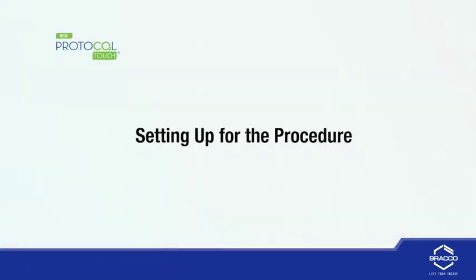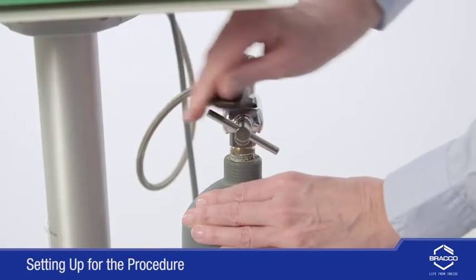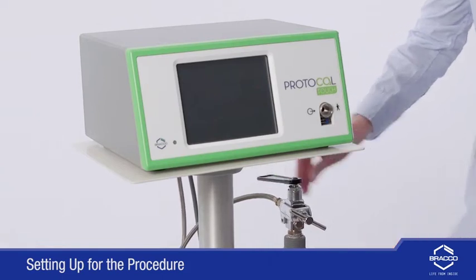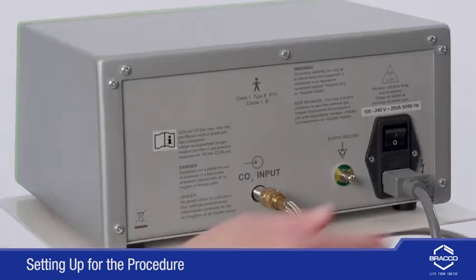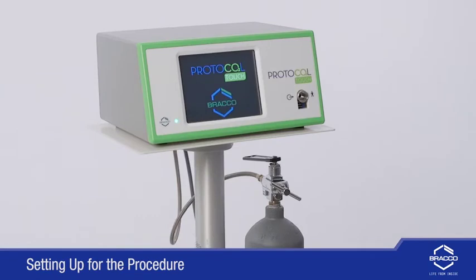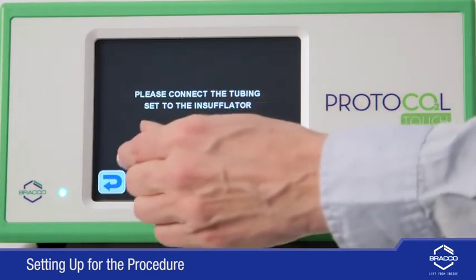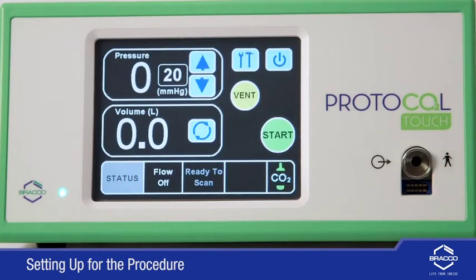Now let's get started setting up for a procedure. Open the valve on the CO2 supply tank approximately 1 turn. Turn on the machine using the on-off switch on the rear panel of the unit. The first screen is the main title screen, which stays up for about 5 seconds to do a self-diagnostic check. Touch the LCD screen to turn it on.